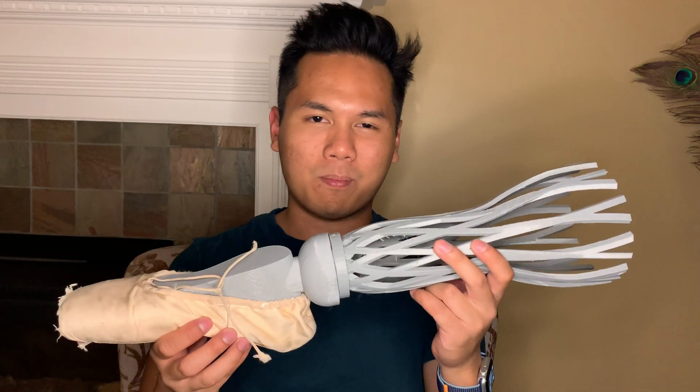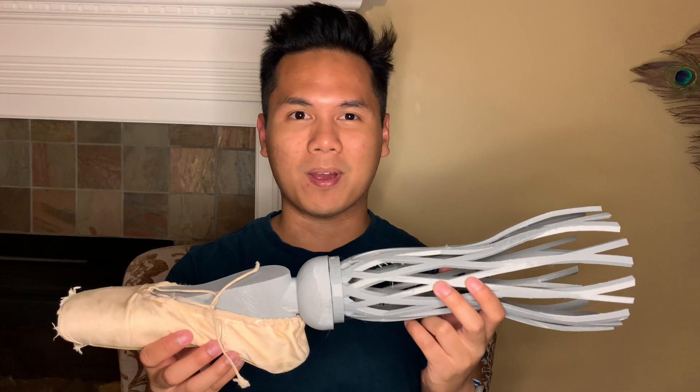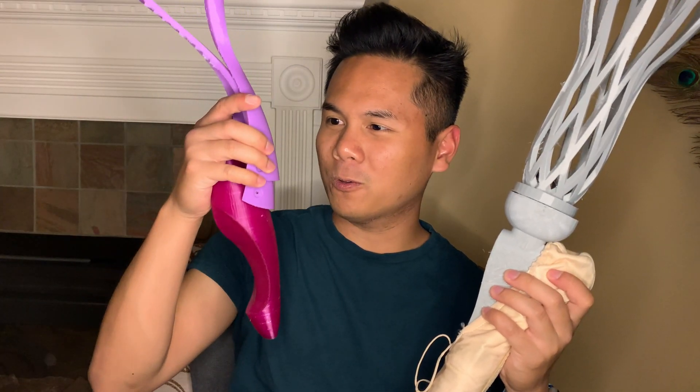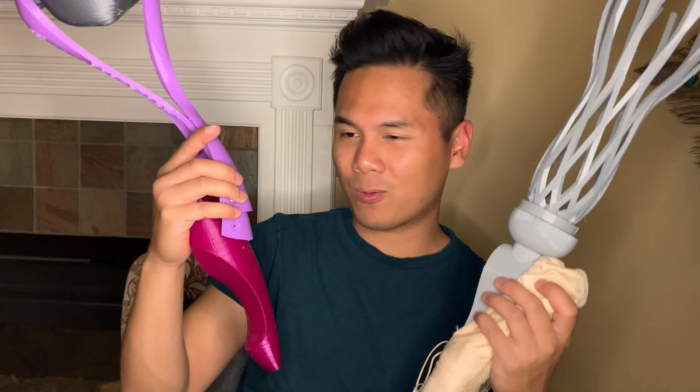Hello everyone, Nikolai here. You probably saw that prosthetic leg that was able to withstand the amputee's weight — I can show it to you right now. This is the prosthetic point shoe, and this is probably the largest print I've ever made in my life. This prosthetic point shoe was inspired by this aesthetically cool-looking design made by Jaehyun. This blew my mind quite a lot.